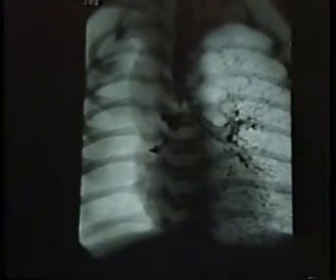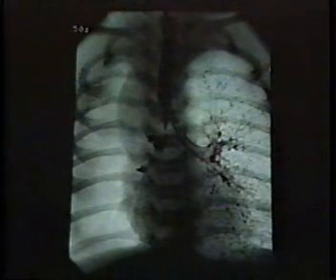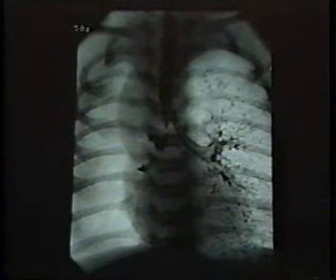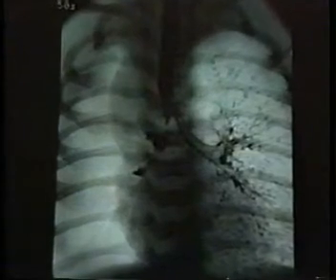Well, we were completely convinced that this patient had an abnormality of the right bronchus because of the retained fetal fluid, and underwent a water-soluble tracheogram while the MR machine was being repaired over the Christmas holiday. It was down, as is typically the case, and it showed striking abnormalities as illustrated, with proximal right bronchial narrowing.